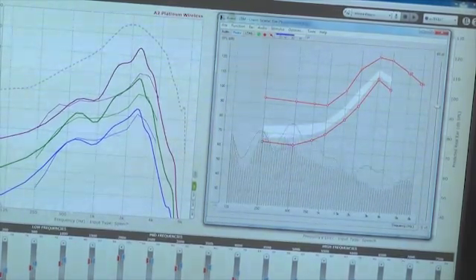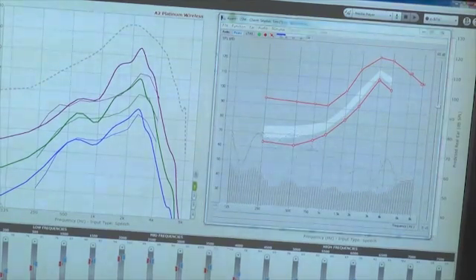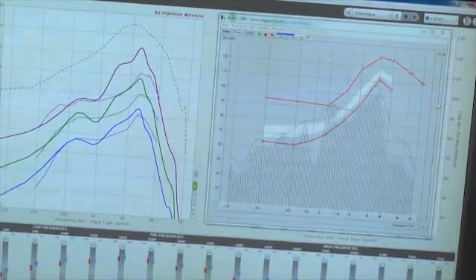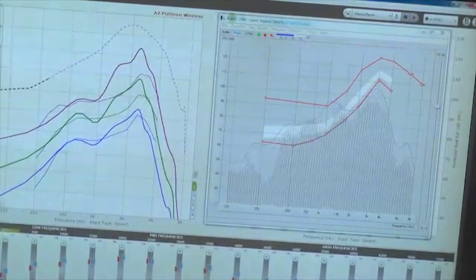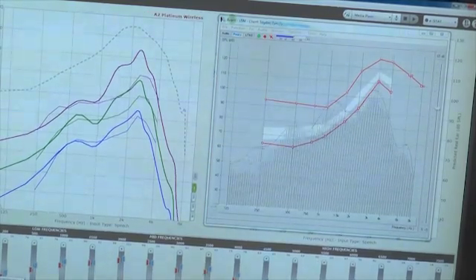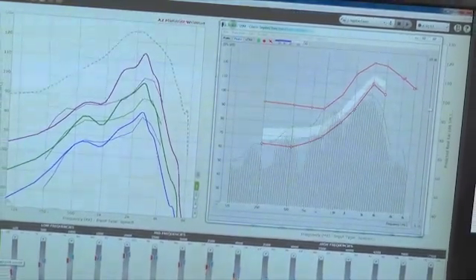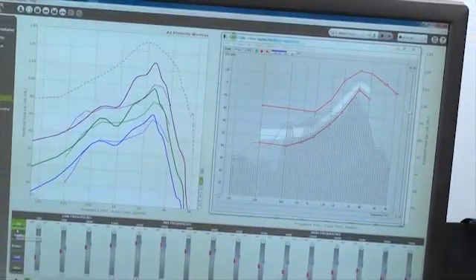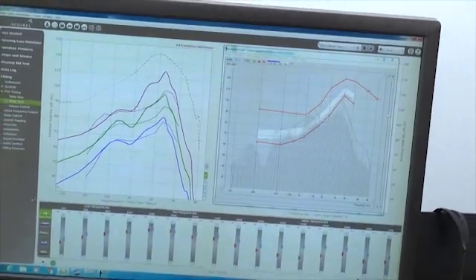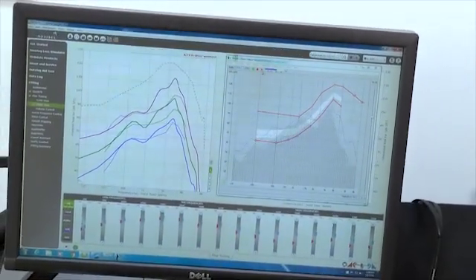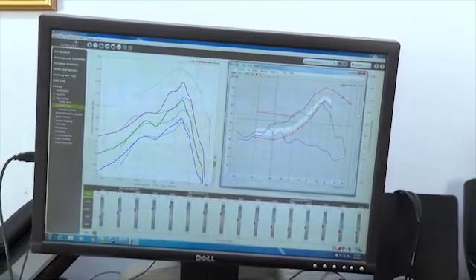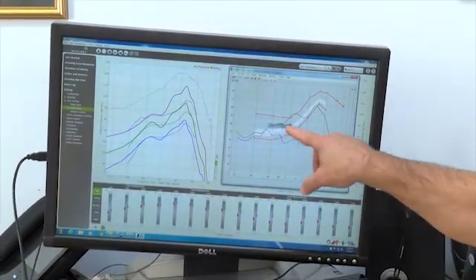And we'll run this again. Now it's on again, but now I'm going to turn his hearing aid on. And I stop it and you can see the difference in the two.